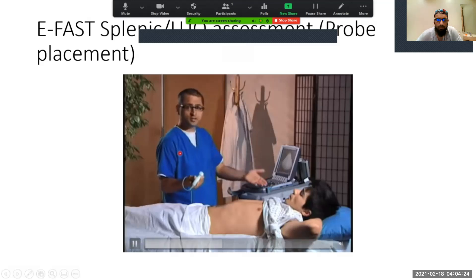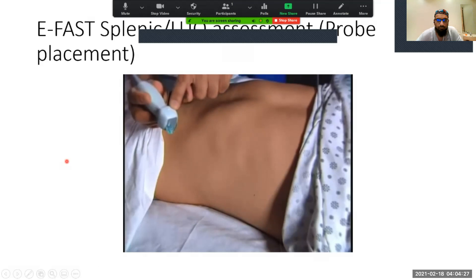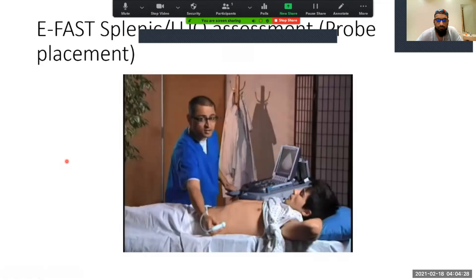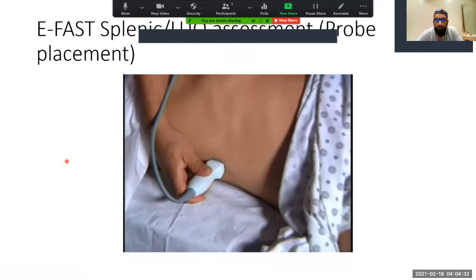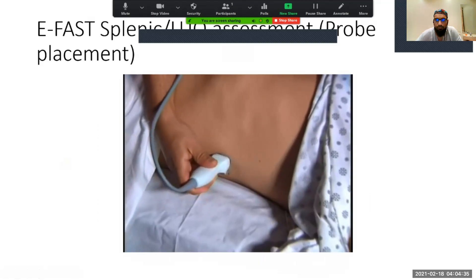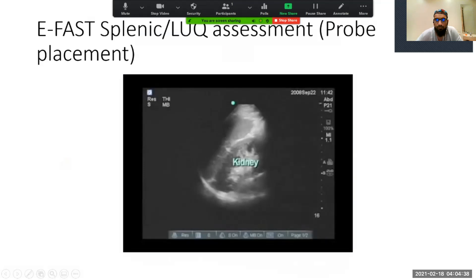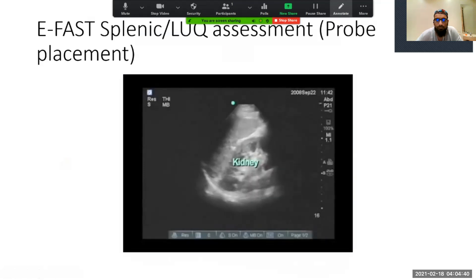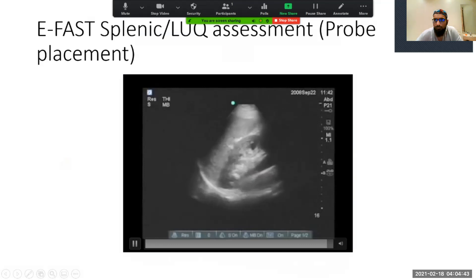The patient is going to be supine. This is the probe marker right here — I'm going to go really posterior, my hand is going to touch the gurney, and you can go about four finger-breadths just above the costal margin. You can identify the kidney; that's going to be a pretty identifiable organ and you can see it here on the screen.